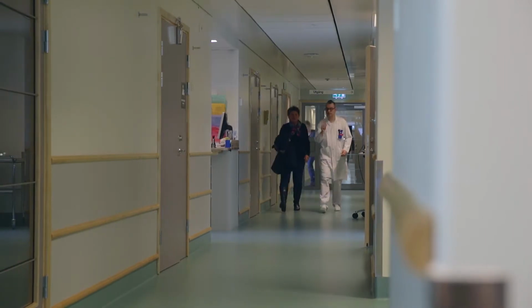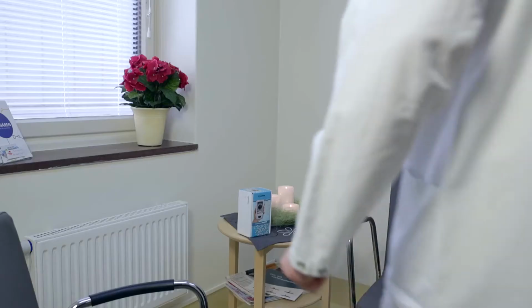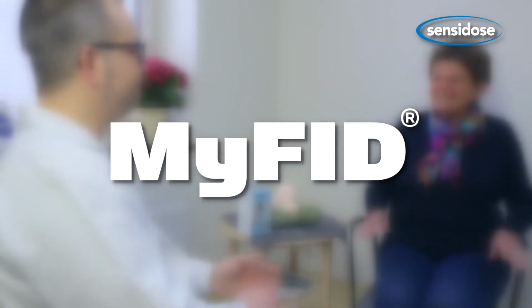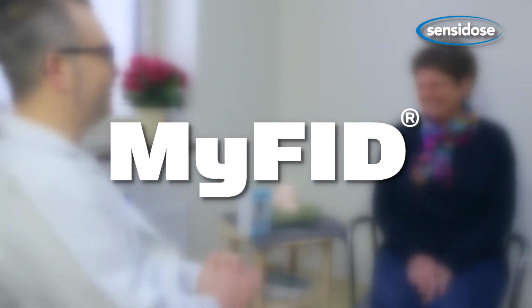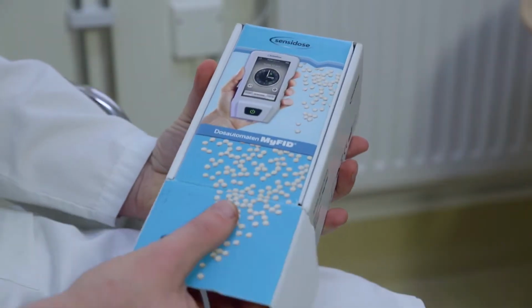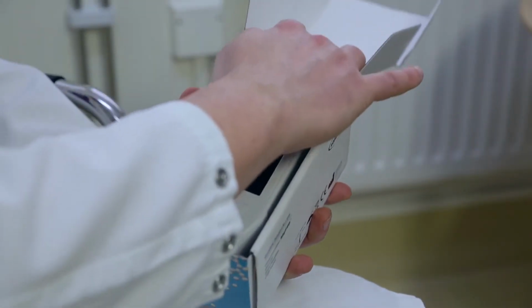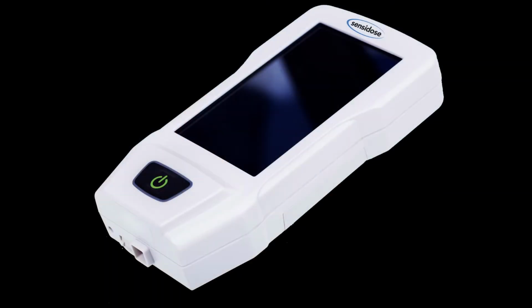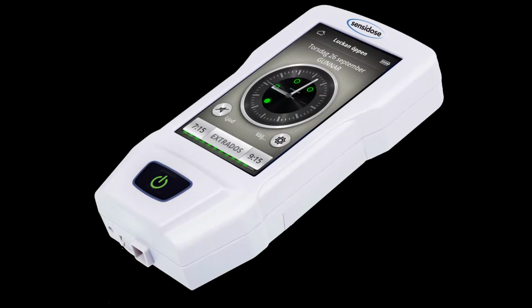Welcome to an instructional video for the SensiDose new dosing device named MyFID, which stands for My Flexible Individual Dosage. If MyFID is brand new out of the package, it must be charged for a few minutes before programming can start. Plug in the charger and wait. The screen starts up when it's ready for programming.